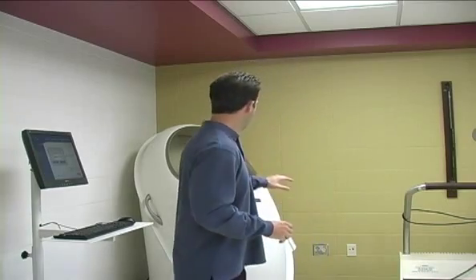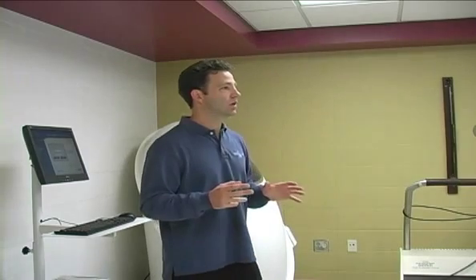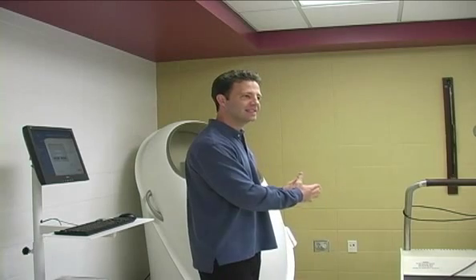So when the BOD pod is compared to the 4-compartment model, it compares very favorably. It's within plus or minus 2%. When DEXA is compared to the 4-compartment model, it does not compare favorably, which is very interesting because, as I mentioned earlier, many times the 4-compartment model uses a DEXA for the bone component. So you would think it would be slightly more accurate.